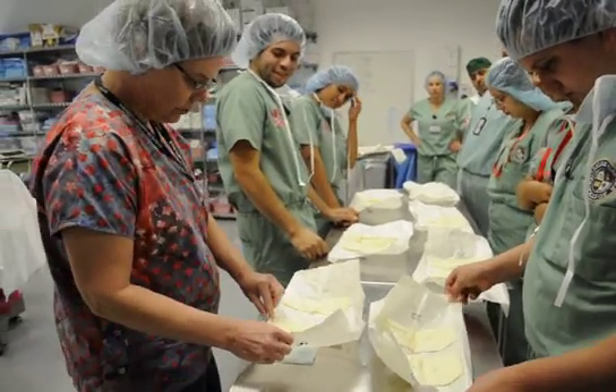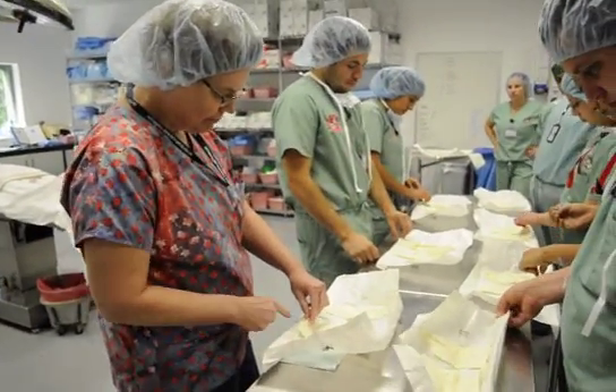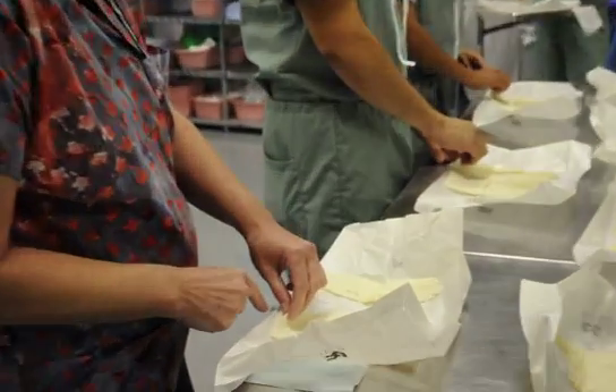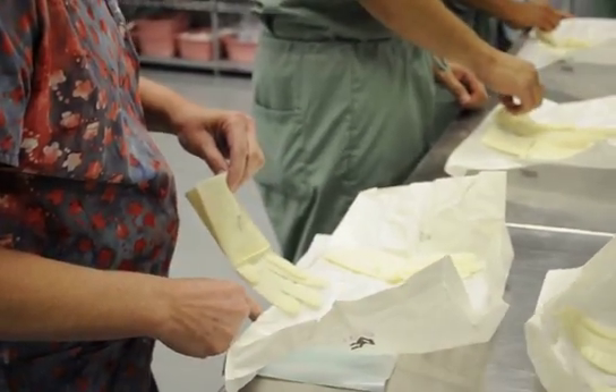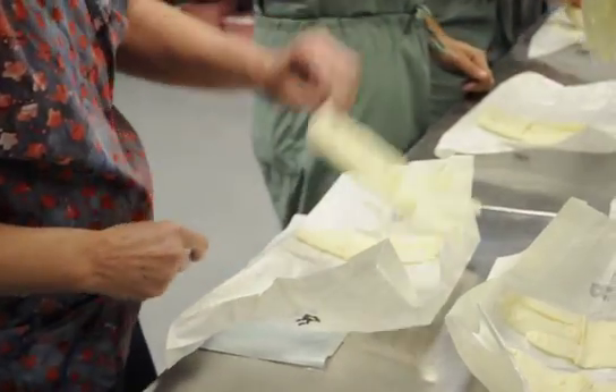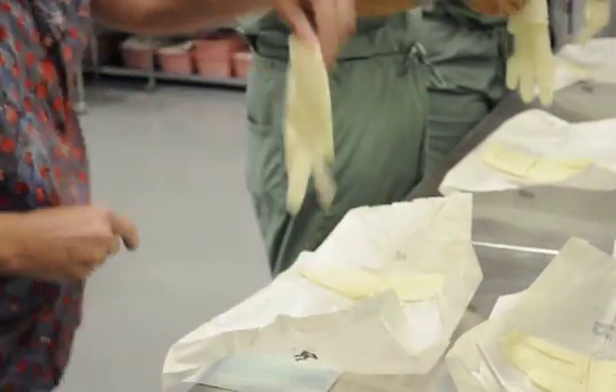Then the first glove you're going to pick up — if you touch the paper, it's okay. But when you go to pick up this glove, don't be taking it down like this, because you just touched the end of this wrapper. So you pick it up carefully.